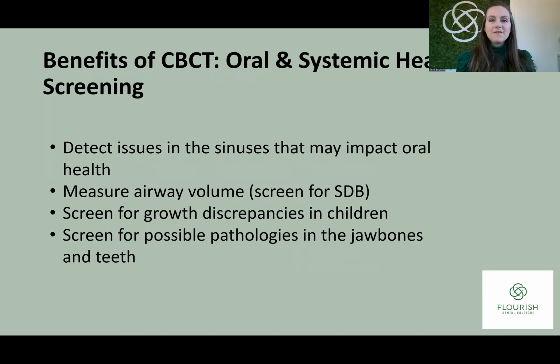Now, some of the benefits of CBCT are, for one, screening for oral and systemic issues. A CBCT can detect issues in the sinus that may impact oral health. We can measure airway volume, so we can see if you're breathing through, I like to tell patients, a PVC pipe or a coffee straw, with the PVC pipe being much more optimal than the coffee straw.